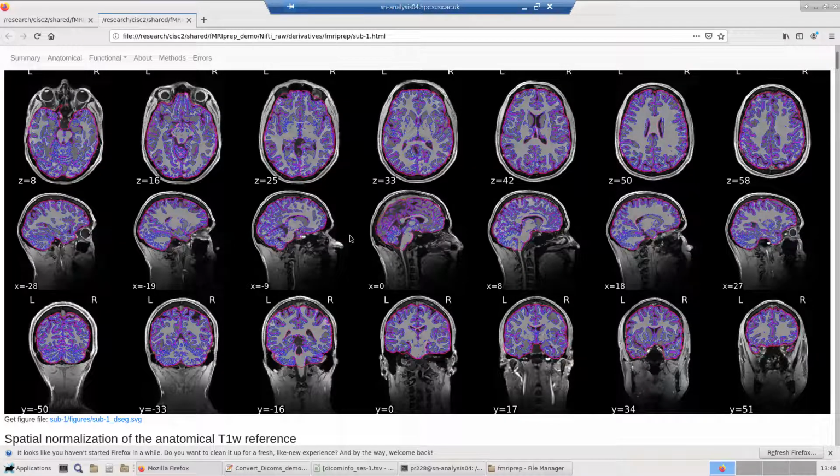This is slightly different from the Human Connectome preprocessing pipelines, or other consortia like the Child Mind Institute preprocessing pipelines, where they assume that you have collected exactly the same data set as them, using the Workbench and exactly the same thing. Whereas here, there is more flexibility in assuming what was collected and when. So in that sense, compared to other such pipelines, this is slightly more flexible to different types of data sets.